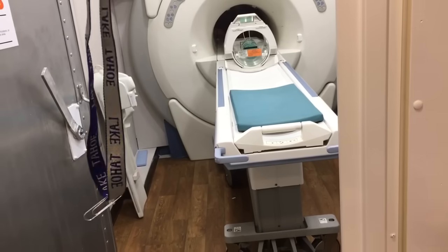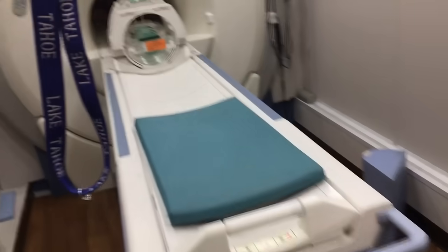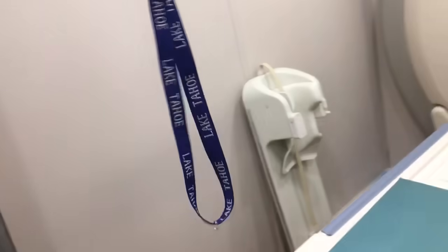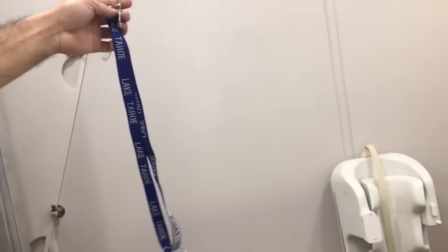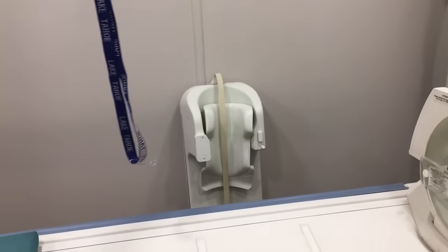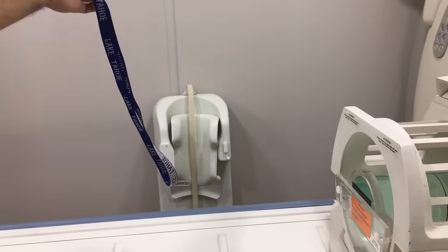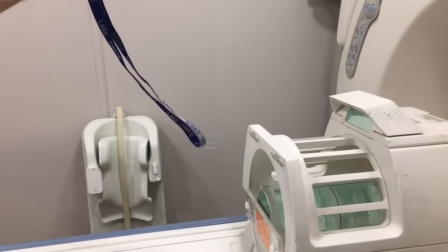We're just walking into the MRI room now. We're about eight feet away from the bore. I'm going to get on this side angle so you can actually see the pull as I'm getting closer. Now we're starting to reach the head coil here, and we're starting to see some pull at about four feet away from the magnet.